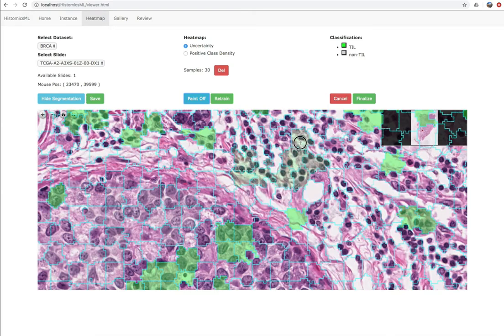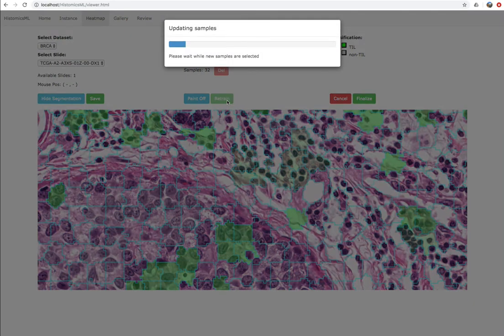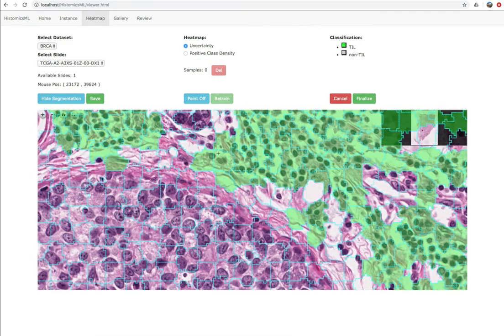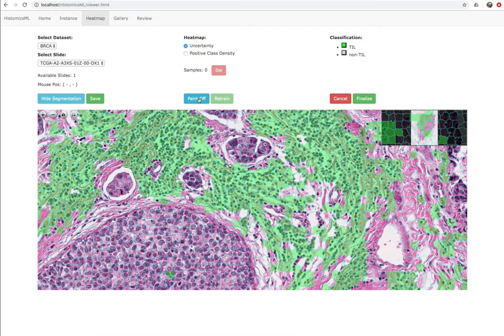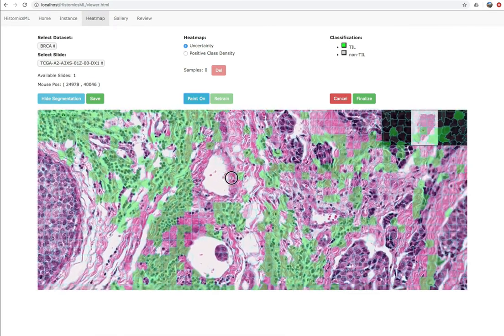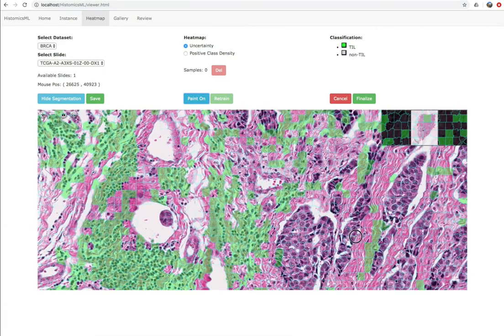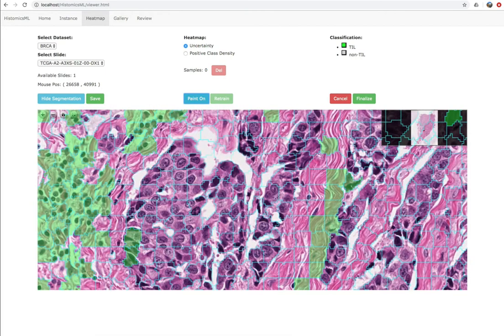As you drag the paint tool, you'll see that the colors change, indicating a change of labeled class. After labeling, click Retrain to update the classifier and see the improvement in prediction accuracy. We suggest frequently retraining the classifier after adding small numbers of samples for faster training. This will help the classifier converge more quickly and will minimize your labeling effort.